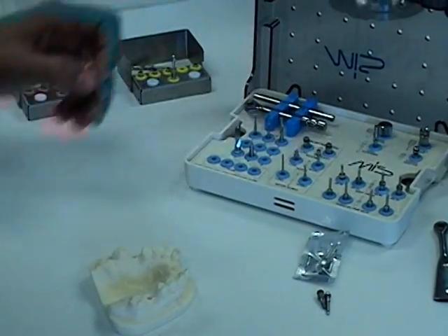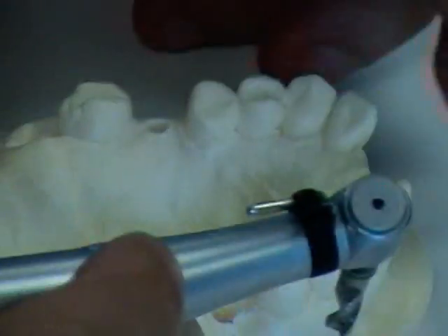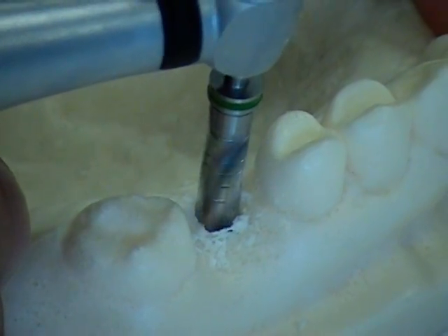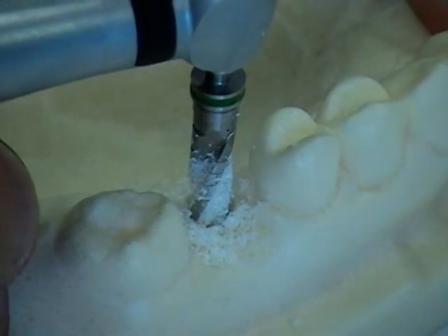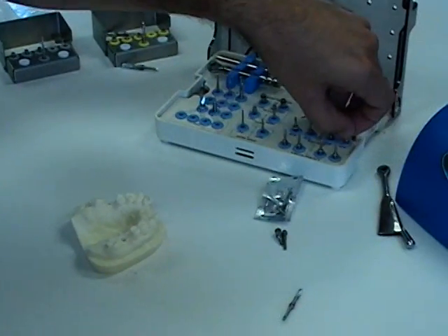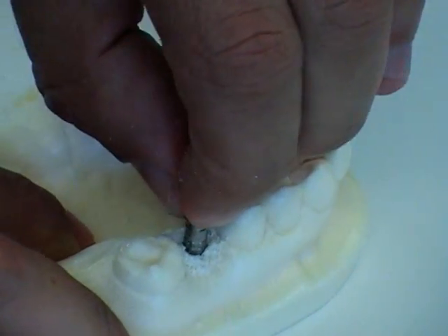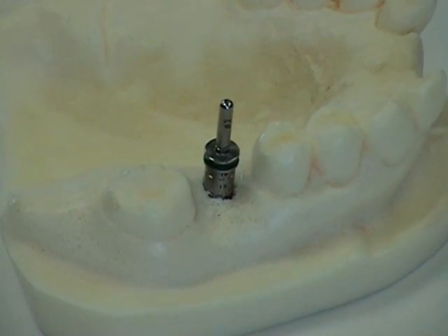The next diameter is the green colored 4.5mm twist drill. Again, verify the depth using a body try-in. Notice that when inserting it, it should continue to go to the 13mm mark. The osteotomy is 13 millimeters total depth. You can also see the spacing and angulation is favorable compared to the neighboring teeth and its placement on the ridge.